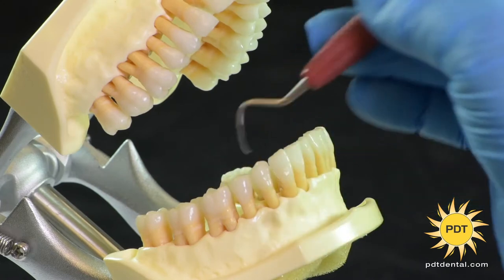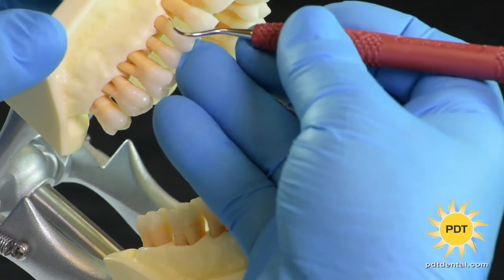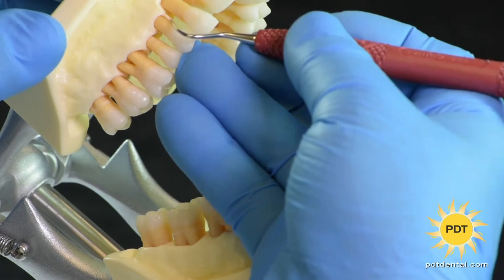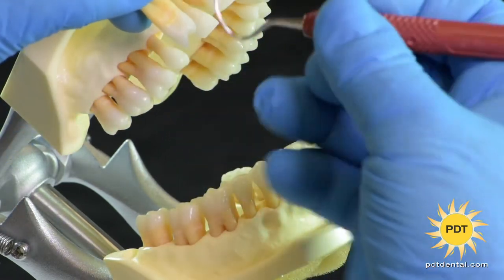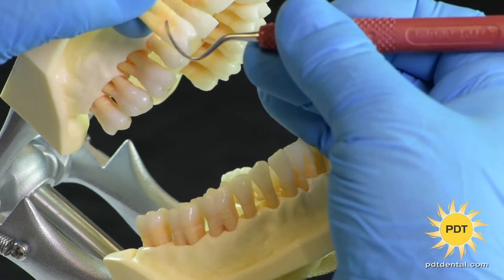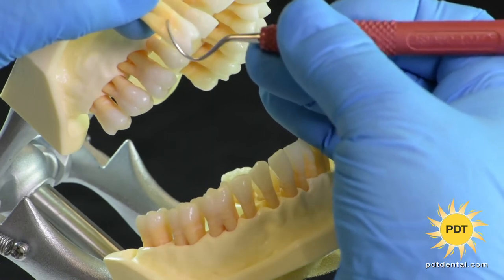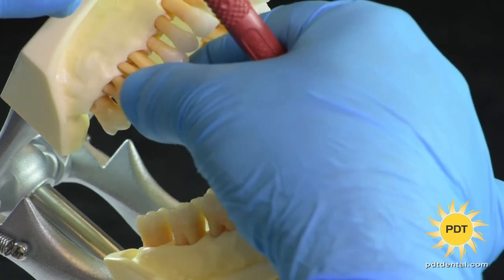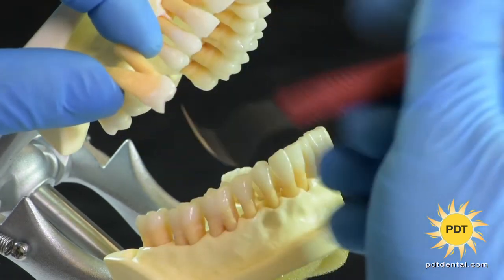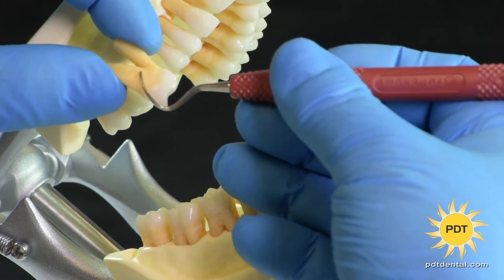The unique shape and longer blade offers increased access over shorter Gracey and universal curette blades with less tissue trauma. The Queen of Hearts helps you reach and remove calculus more effectively on mesial depressions of maxillary first bicuspids and the mesial and distal furcations of maxillary molars.